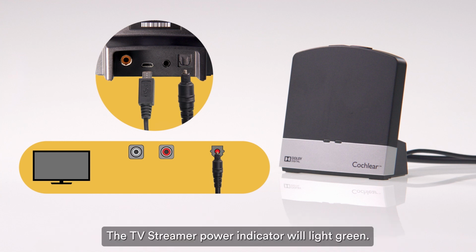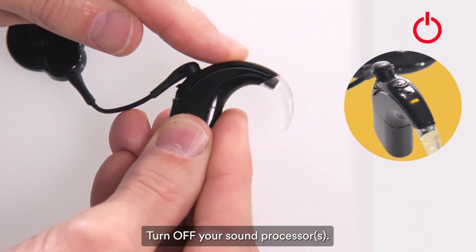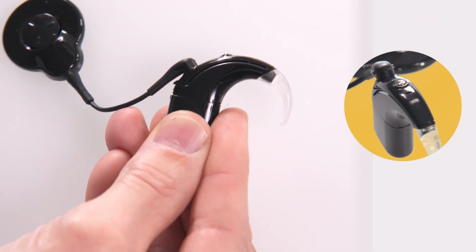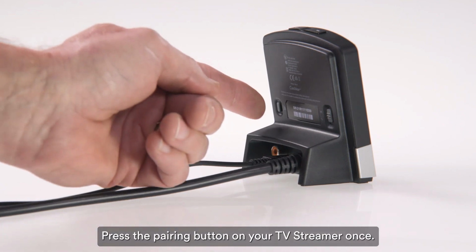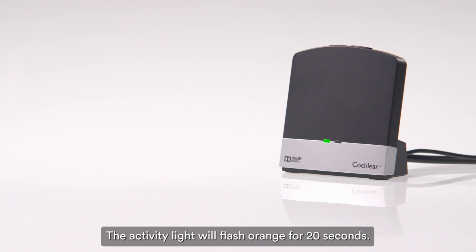The TV streamer power indicator will light green. Turn off your sound processor. Press the pairing button on your TV streamer once. The activity light will flash orange for 20 seconds.